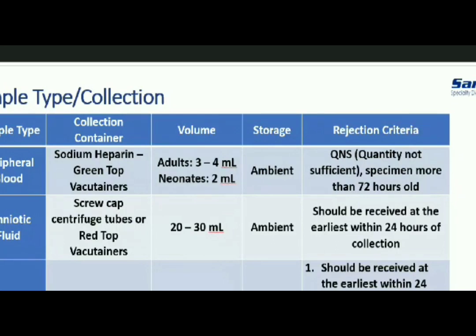The sample may be a tissue. Sometimes, at the time of a fifth month abortion, the doctors send the whole baby attached in one container to the lab. Please understand the criteria here. Please inform the doctors or laboratory technicians to dissect the tissue then and there, about 4 to 5 grams, and send it in normal saline. Don't send the whole baby. The sample should be dissected from the armpit or thigh, not from any other parts. A placenta is also fine, but don't send other tissues. This is very important.